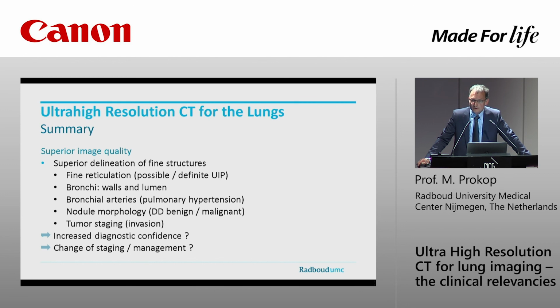What we've seen in our institution is that you get used to these new scanners very, very rapidly. And when you look at images from the past or from other sites, you realize how different the quality looks and what you have been missing in the past.